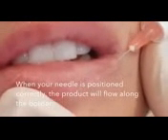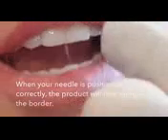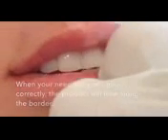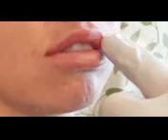It looks like it's in a big ball over here, but when you take the needle out, it flattens. And we're just doing lighter on the border than we did last time because there was still stuff in there, right? Seeing the contour is perfect. That's what you're looking for, is the contour. There's a little dip right in a smidge right there.